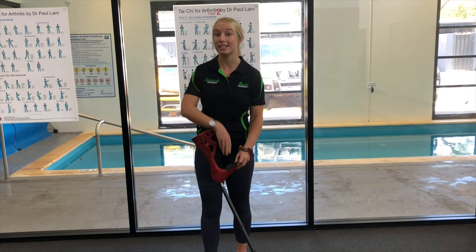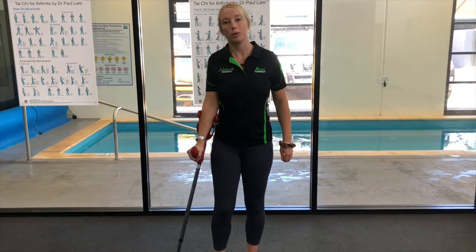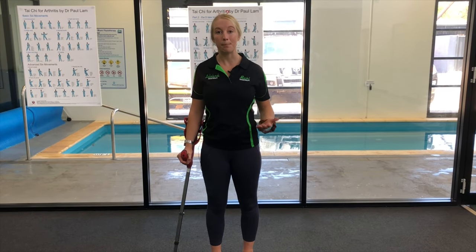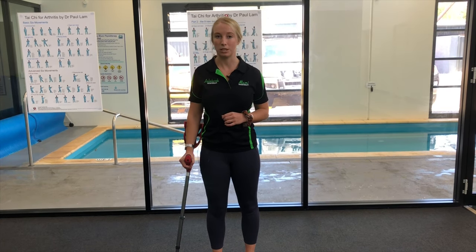If we were to do it on the same side as the injury, when we walk, we tend to walk with a little bit of a limp and we don't keep our balance nice and even. This can start to lead to imbalances through our hips and through our lower back and start to create more problems than it's worth.